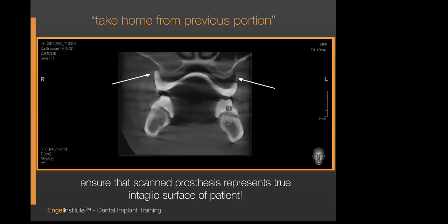For the lower, we are going to use 6. We are going to use 2 on the buccal to push the tissue out, the lips away from the face. We're going to have the patient lift the tongue. We're going to put 2 under the tongue to keep the soft tissue away from the teeth. And then we're going to use 2 more for them to bite on between the bicuspids and the molars. And if you can move the soft tissue away, it makes the merging much more clear and easy. It makes the whole surgery that much more clear.